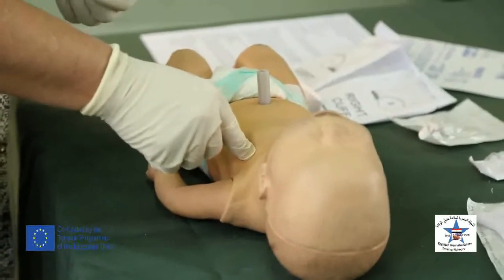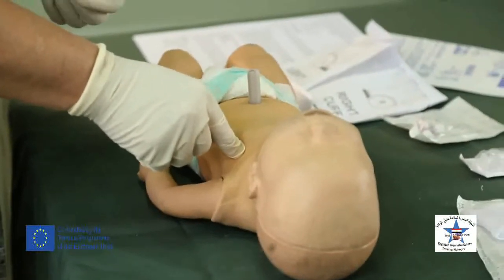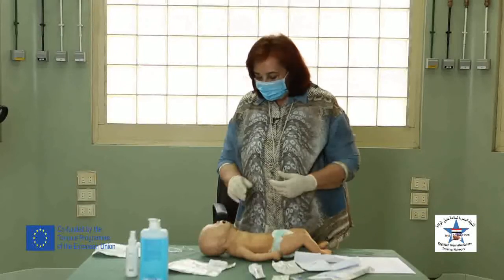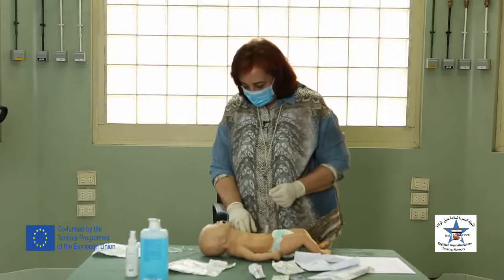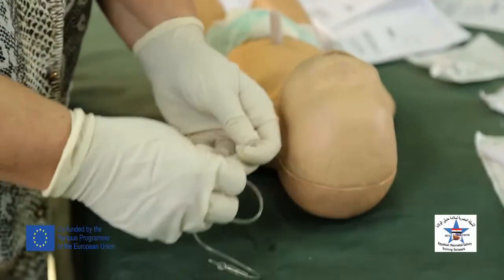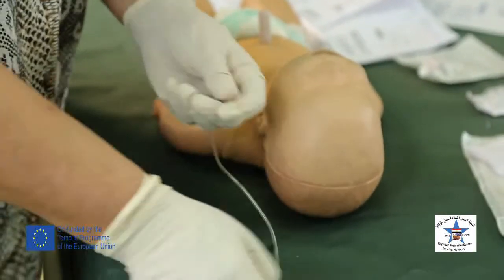If I have a marker, it's better to mark the site of insertion. Then, if it is possible, I can give a local anesthetic to the baby if time permits. If not, and the condition is an emergency, I will perform the procedure directly.